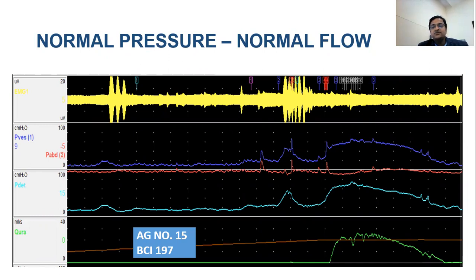And you see that once the patient was given the command for volitional voiding, the patient did generate good detrusor pressure and voided with very good flow. In this, as per adult parameters, it was unobstructed with a good detrusor.